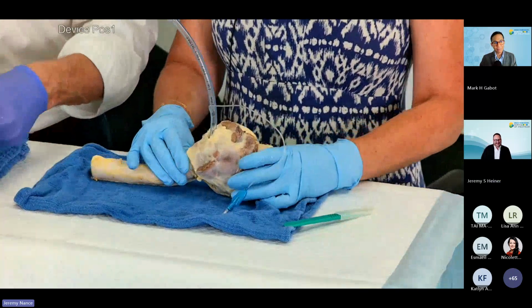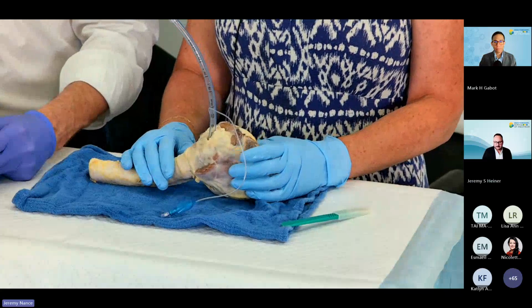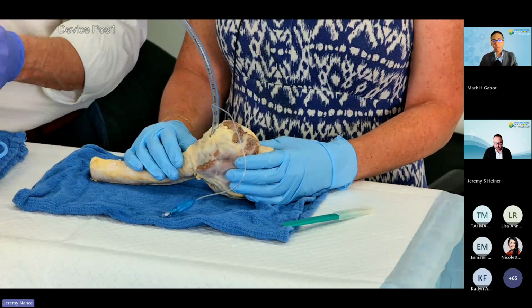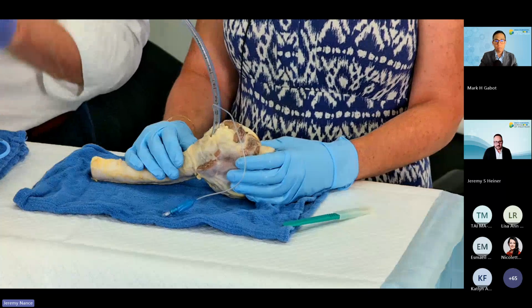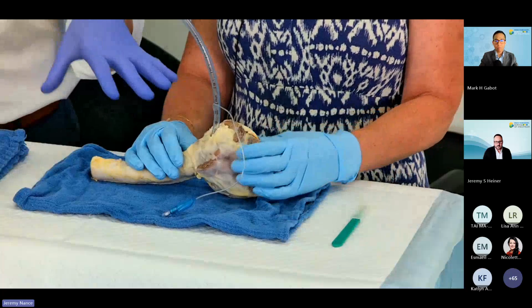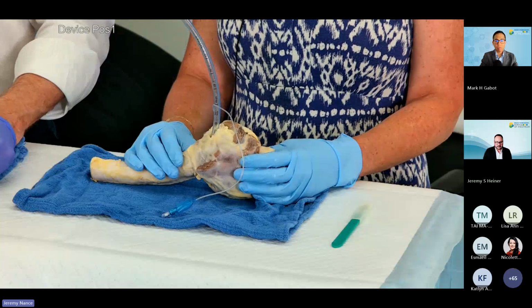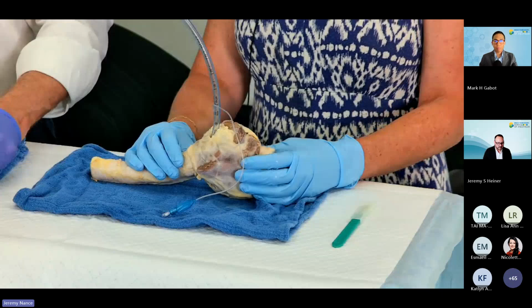Jeremy, in your experience, I'm not sure if you've done this on a cadaveric model or not. I feel like when we use a 3D printed model, where we're using maybe a piece of metal tape as our cricothyroid membrane, it's always a quick puncture and you just feel like you're through. But with the pig model, I think the cricothyroid membrane is probably a little different. In a human model, I'm curious if you've ever experienced not being deep enough or not appreciating how thick it would be.